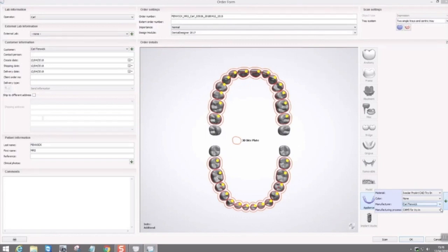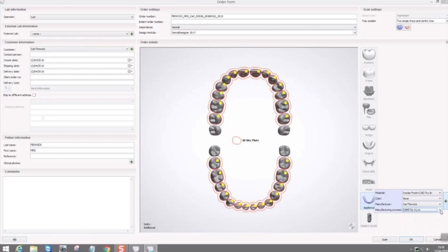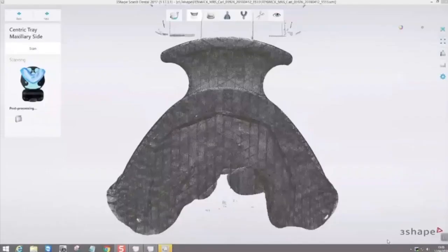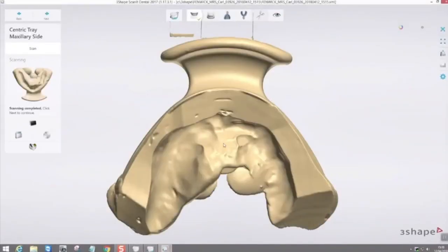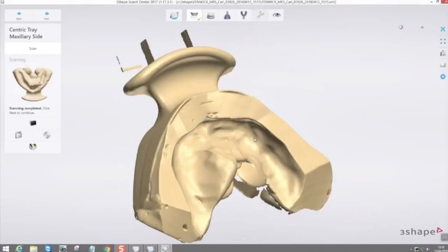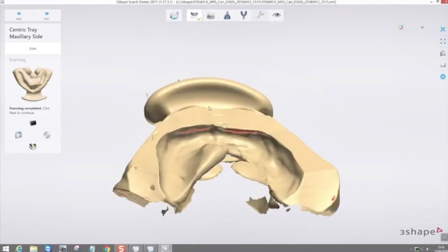You tell it what you're going to scan — regular impressions and a centric tray in this case — then scan. The sequences are short; the scanner takes around 50 seconds and it's very fast. You scan the upper and lower impressions and the centric tray to get your digital models, just like conventional models but much cleaner and faster.